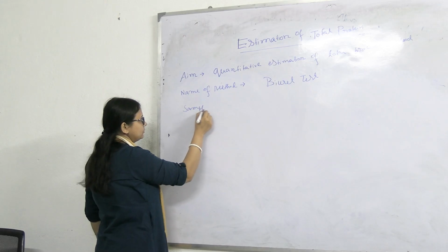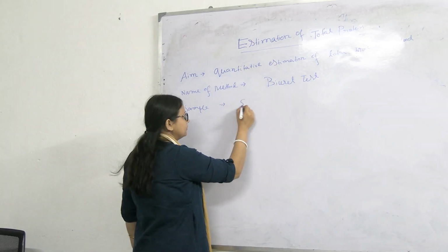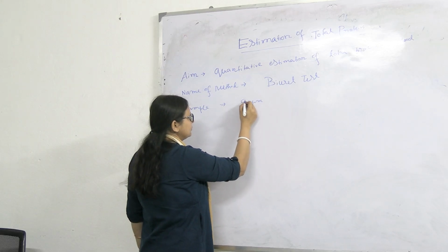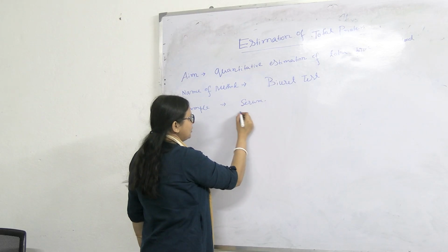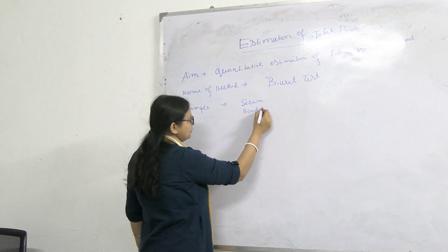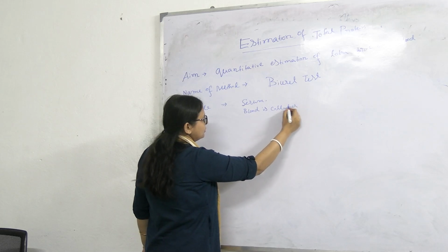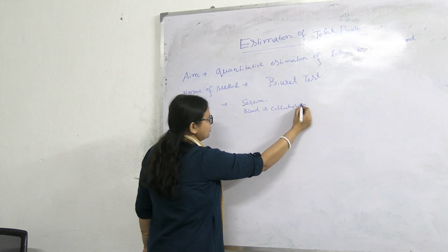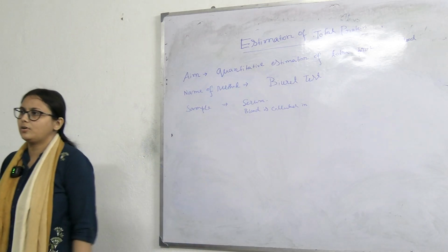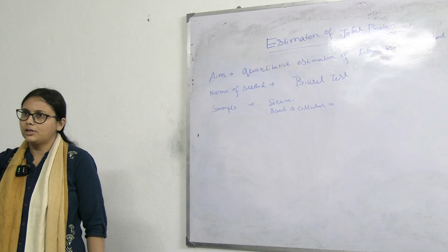Sample: we will take serum. Blood is collected in a vial.